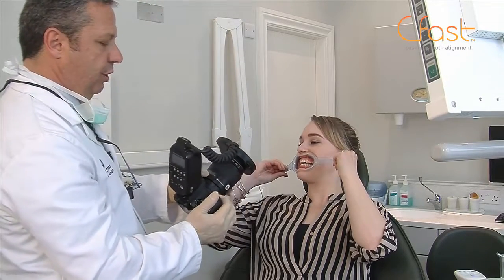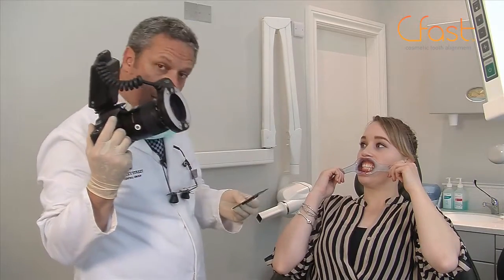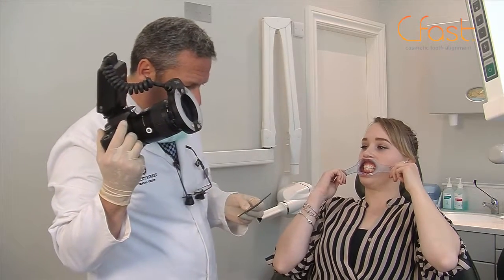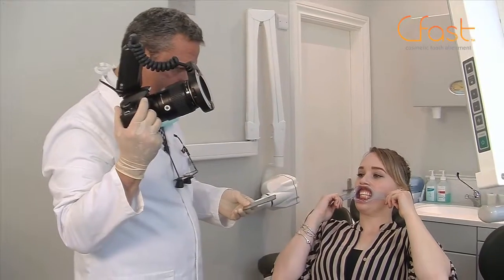It's a 1 to 2 shot, so we're going to have our setting back on number 3. So we've just taken our close-up shots, and my nurse has now warmed the mirror, and we're going to take our occlusal shots. So for this, first of all, on our upper, we're going to have Heather just sit down a little bit lower in the chair. It makes it a little bit easier to get the angle.